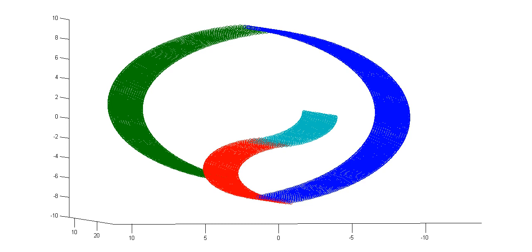But it's pretty recent, but it was used to help find things like the face patches, these areas of the brain that respond to faces. A lot of times an fMRI study, or even fMRI on an individual animal, will be used to locate certain areas, and then people will go in more precisely with electrodes and look at individual neurons.